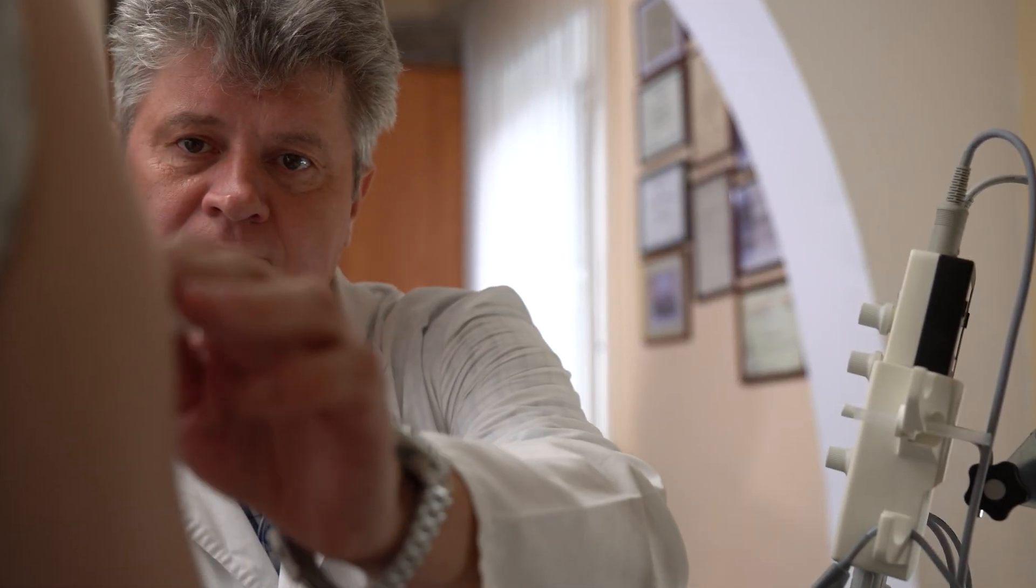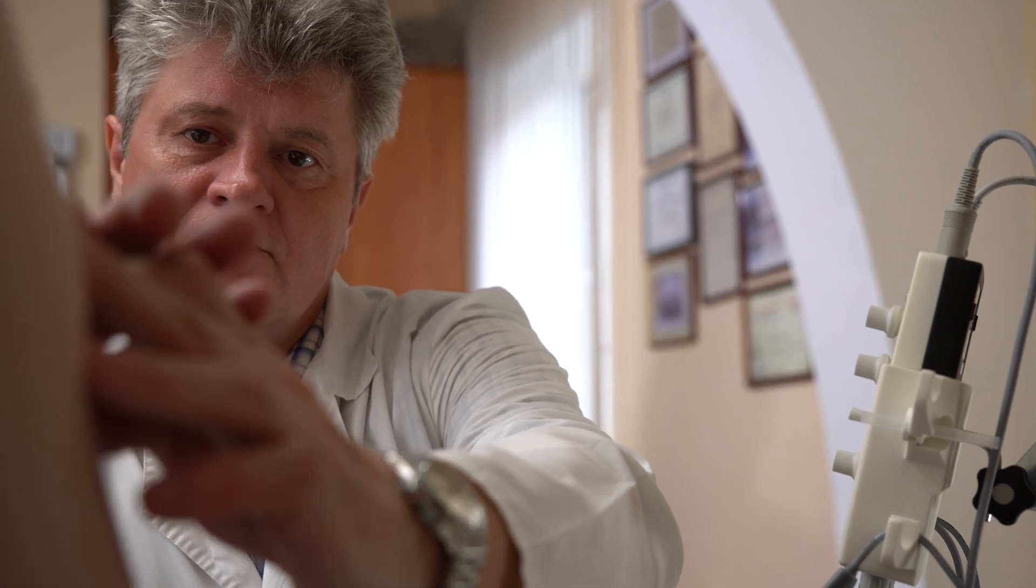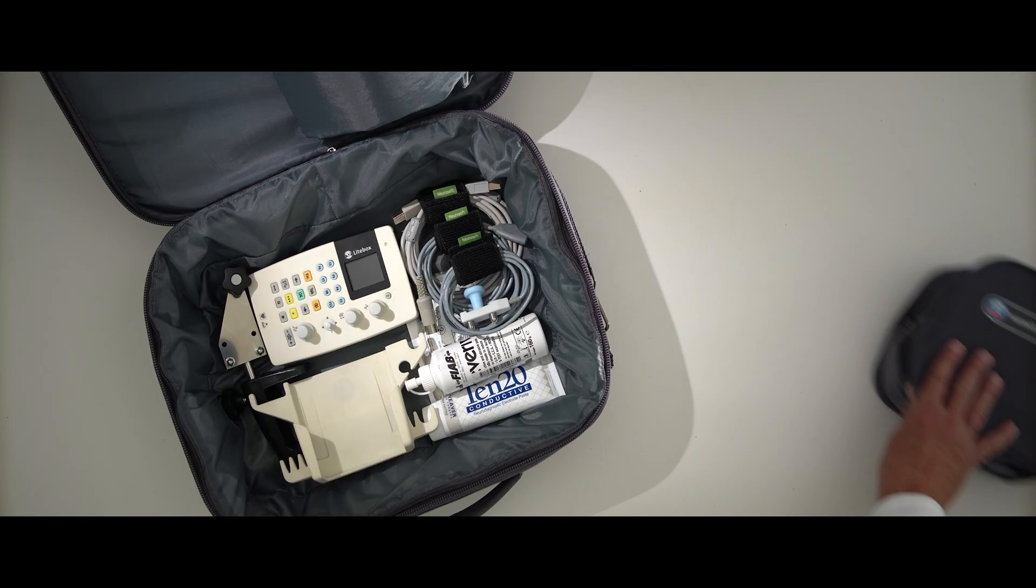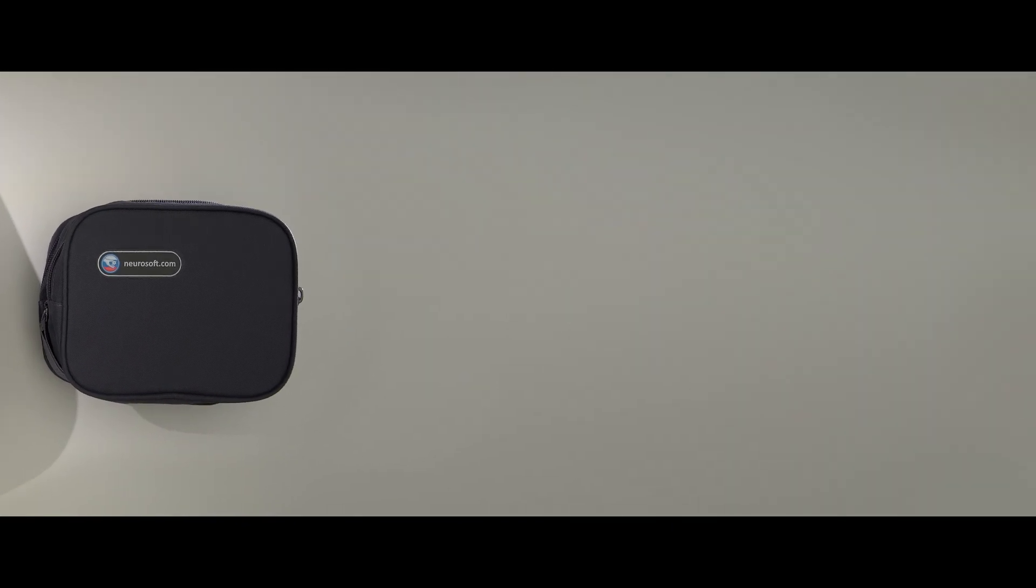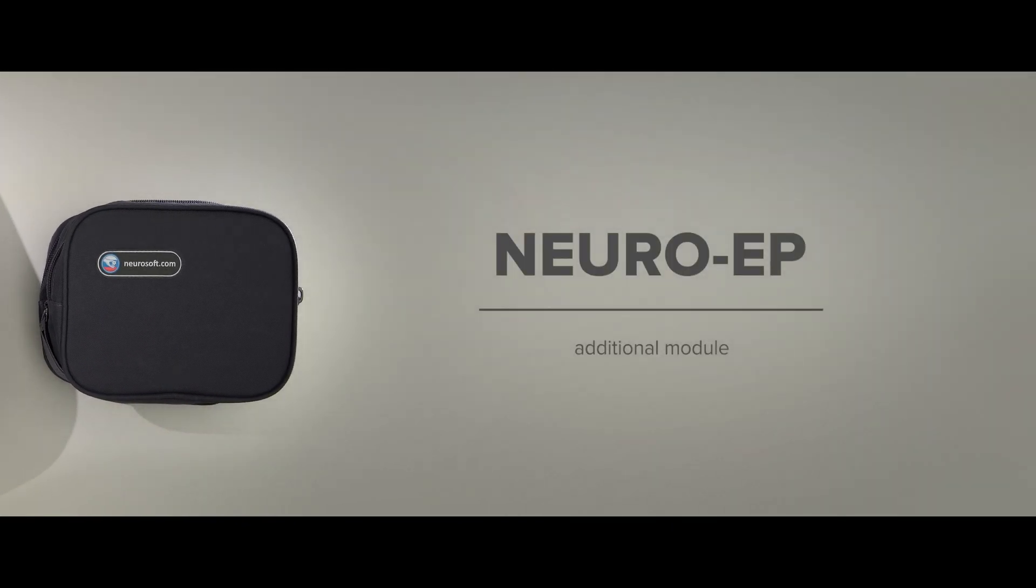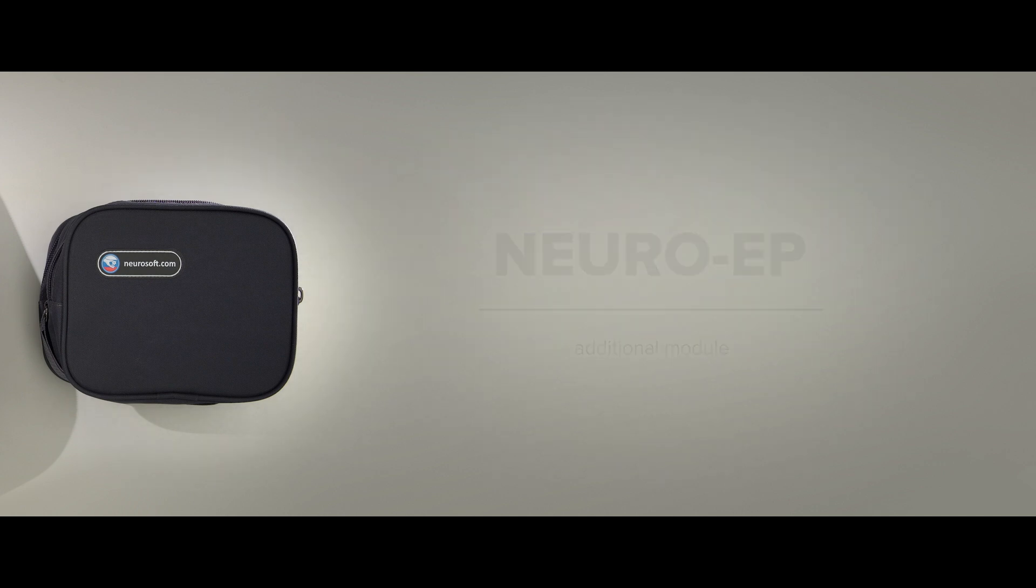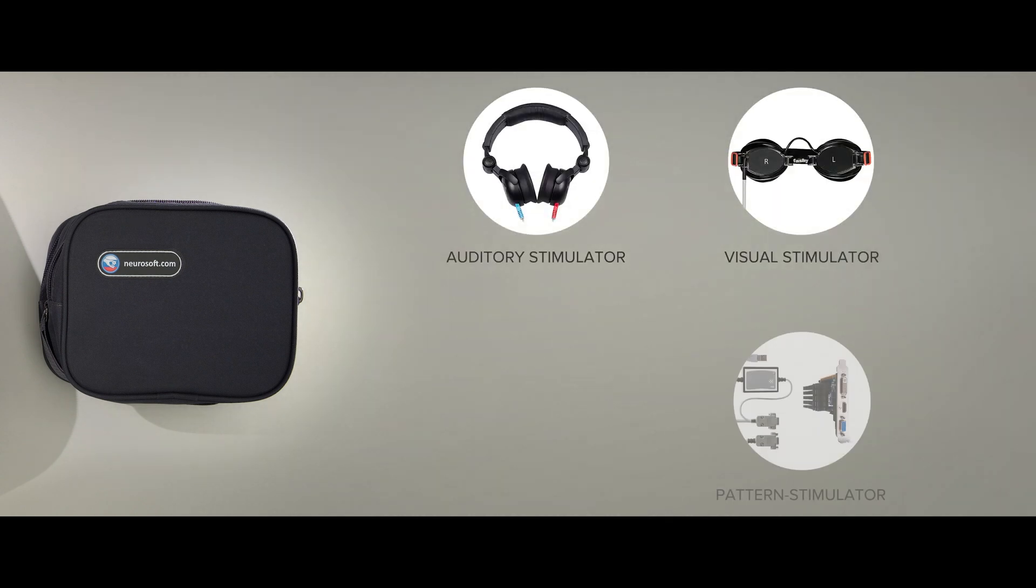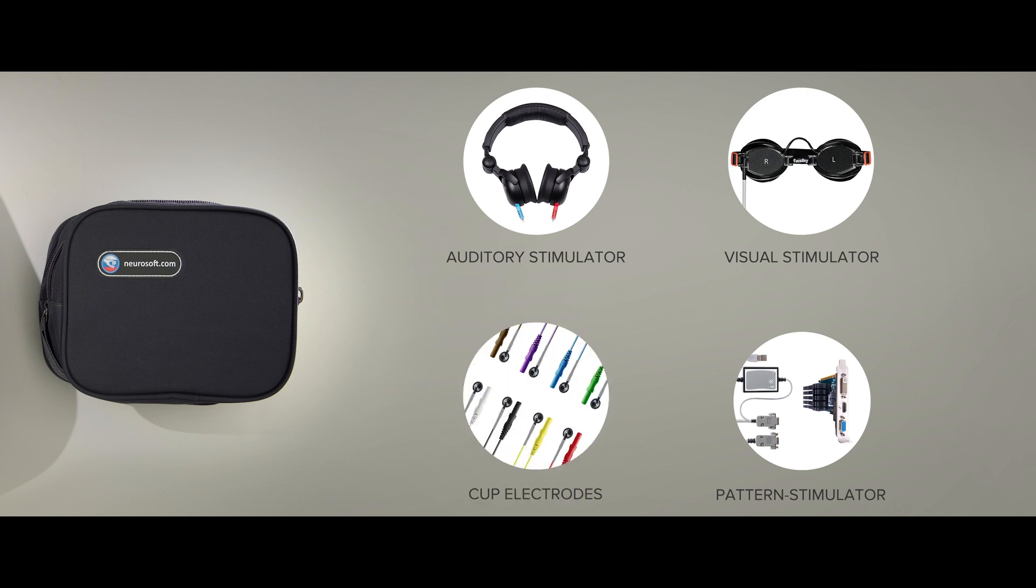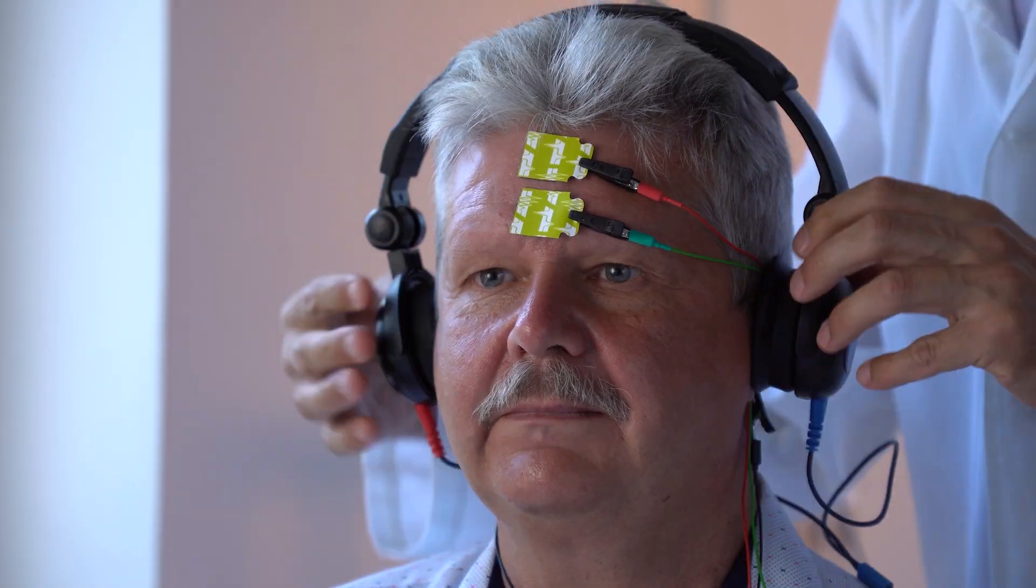Lightbox can be supplied with NeuroEP module for recording of evoked potentials. The module includes auditory stimulator, LED goggles, pattern stimulator, electrodes and software to record short, middle and long latency evoked potentials of different modalities.